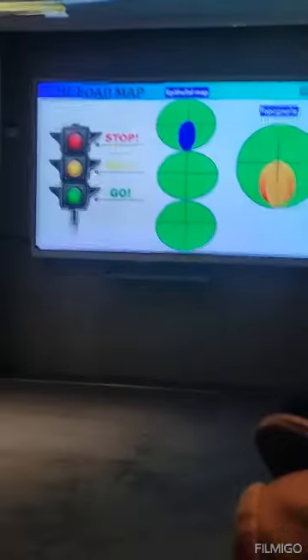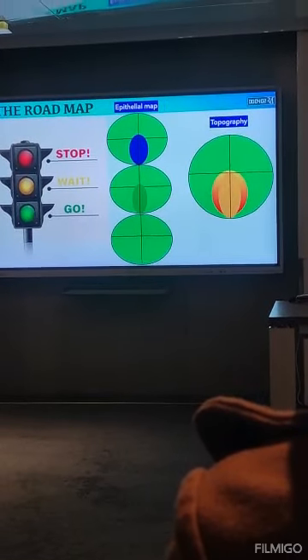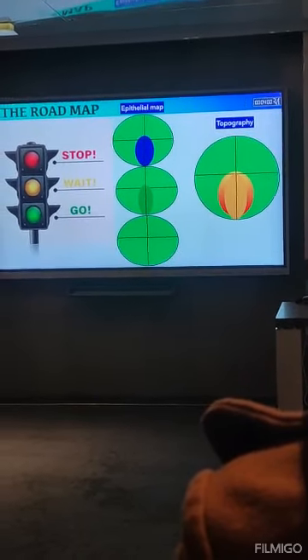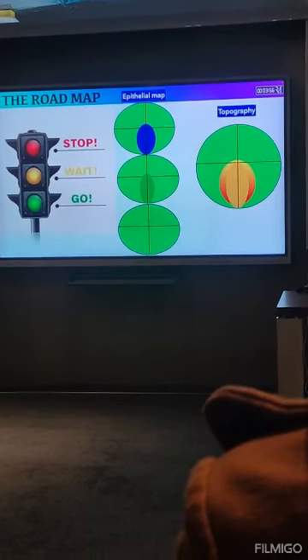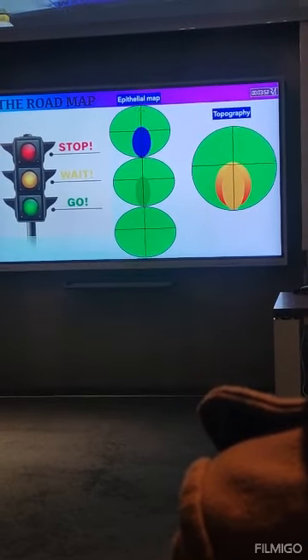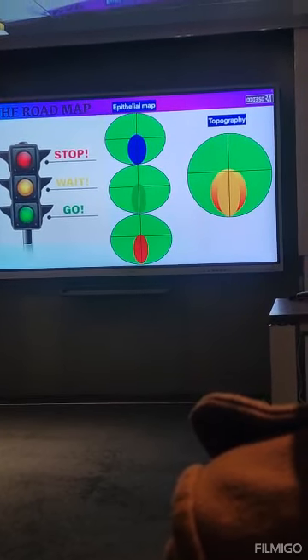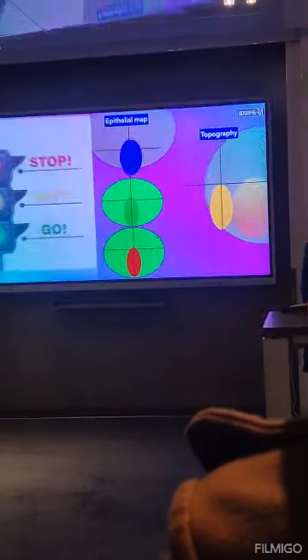If it's blue, which means thinning, you have to stop. If it's just green but with somewhat darker color, with no significant differences between the epithelium at this point or the surrounding points, you have to wait and follow up. Don't go, please. But if you have thickening, which is the red sign, you can go comfortably with no problem at all.